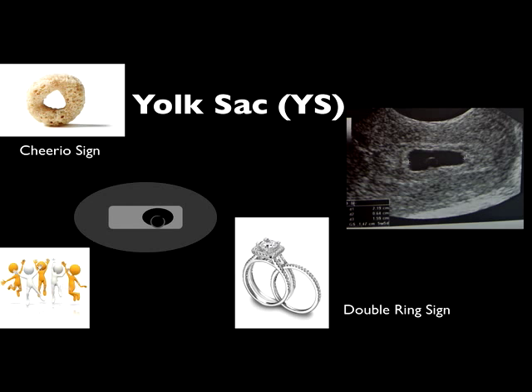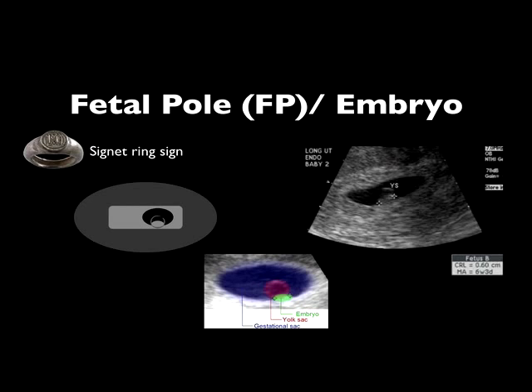The yolk sac has the appearance of an echoic ring-shaped structure, also known as the double ring sign — two rings being the yolk sac and the gestational sac. It's also called the cheerio sign because it appears like a cheerio in the gestational sac. Once we find the yolk sac, our next question is the gestational age and whether we can see evidence of a fetal pole. The fetal pole is the echoic structure right next to the yolk sac, the very beginning of the fetus. It's also called the signet ring sign, and can be used to measure gestational age by measuring the crown-rump length of the fetal pole.